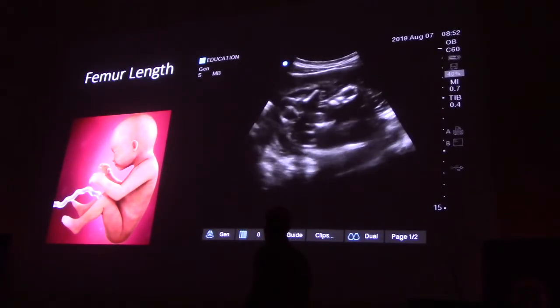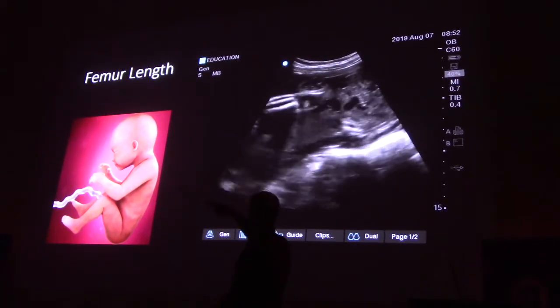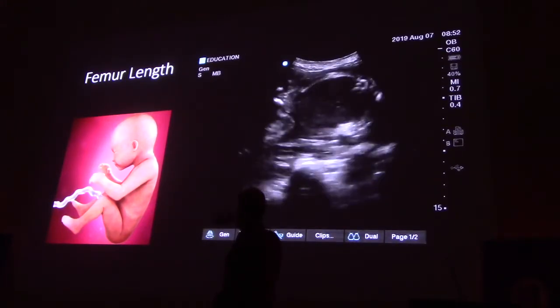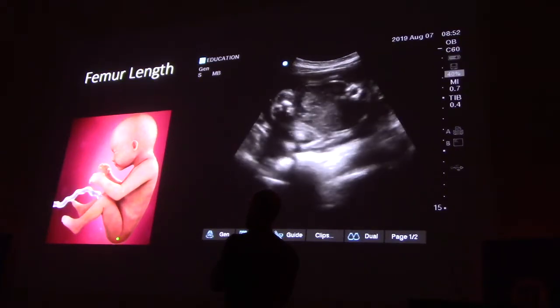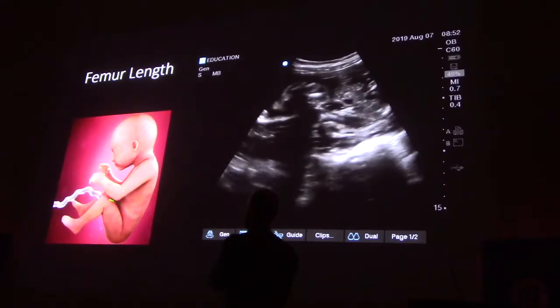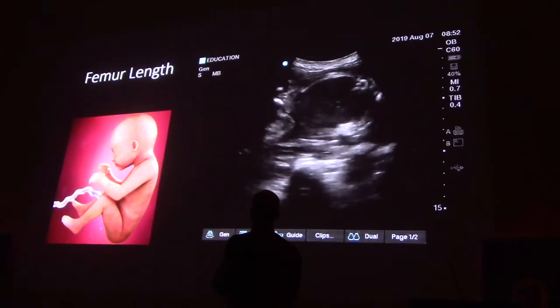So this is kind of an approach that I use. If you think about slicing through the fetal abdomen transversely, you come down, your cross-section is going to be here. And as you sort of fan down here to the pelvis, you're going to find pelvic bones. And off the pelvic bones, you're going to have your femur. So all you got to do is, if this is your plane here, you come down and then you pivot so that you find this plane here. And that's essentially what we're doing here.